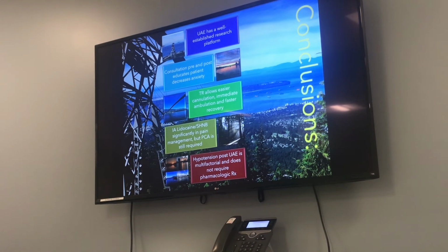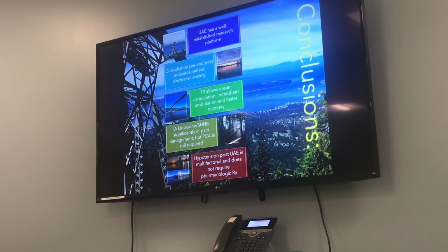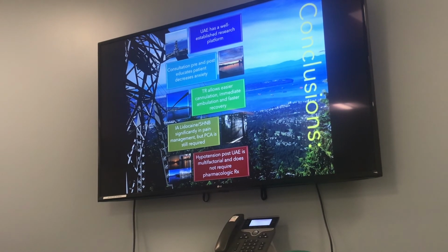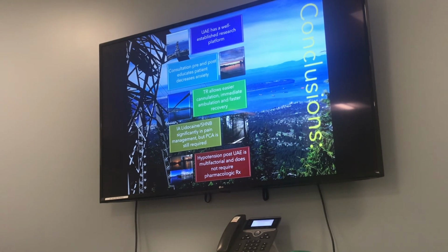And then just one of the questions was about the neurovascular checks in the hand. So it's a very simple thing you have to do. Number one, whether you go through the snuff box or the wrist, there is no major nerve that goes anywhere near that artery. So the chance of having a neurological injury as opposed to the groin is very low. So the things you want to check for, and again, you don't have to do it many times after the procedure. The easiest way to do neurovascular checks is just to leave the pulse ox on the patient's thumb, because you're doing a vascular assessment continually, right?